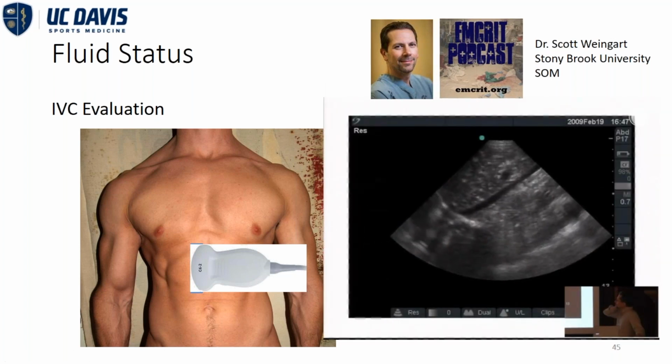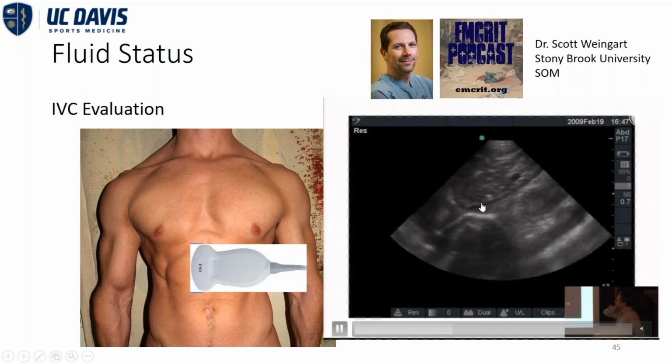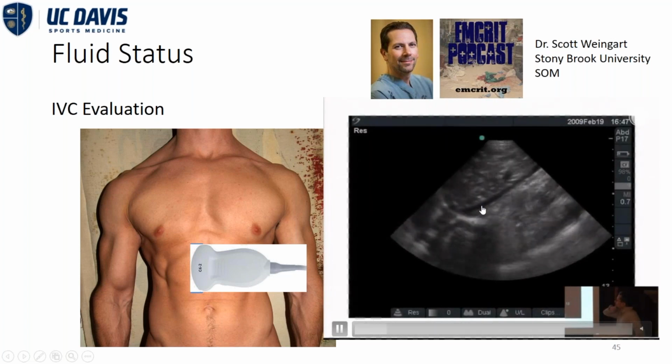Moving on to an example of a collapsed inferior vena cava. Here the image quality is a little bit lower, but what we see on the left of the screen is the right atrium. And we're not clearly seeing the hepatic vein coming into view, but that's okay. We're just going to look 2 or 3 centimeters over. We're going to evaluate the distance here. Now, as far as measuring the distance between the two, that's not as important.